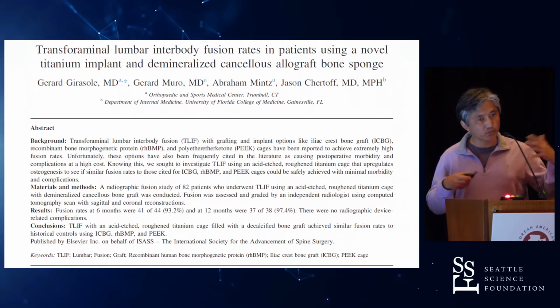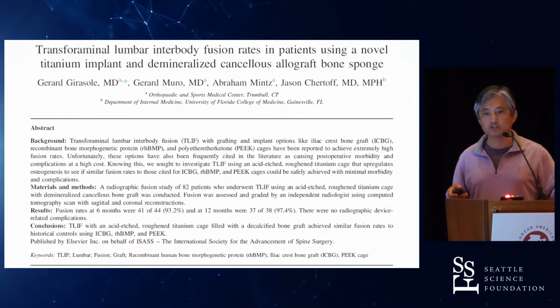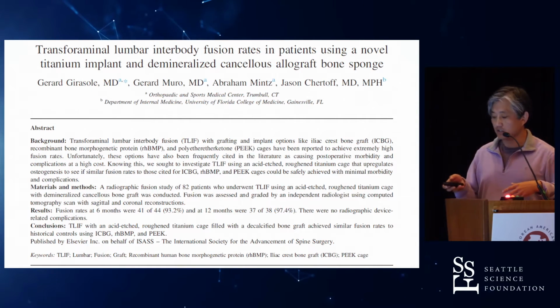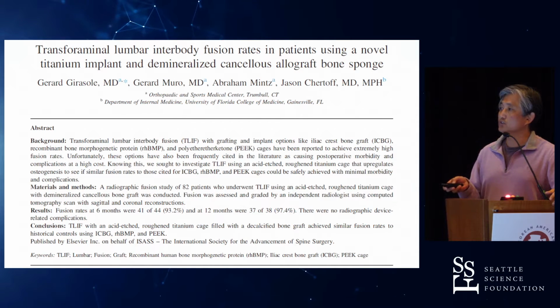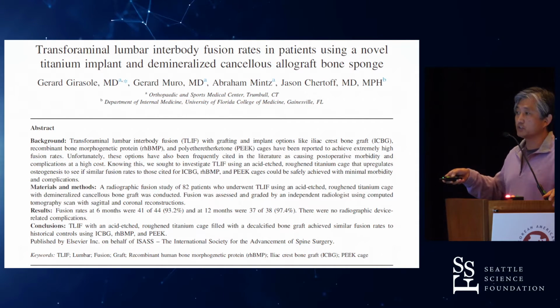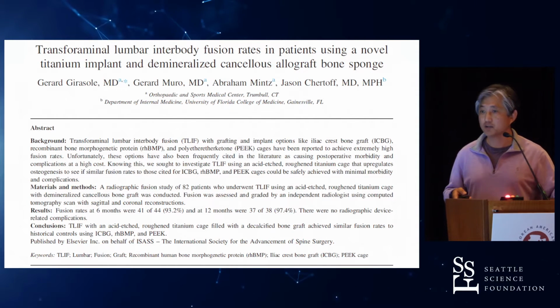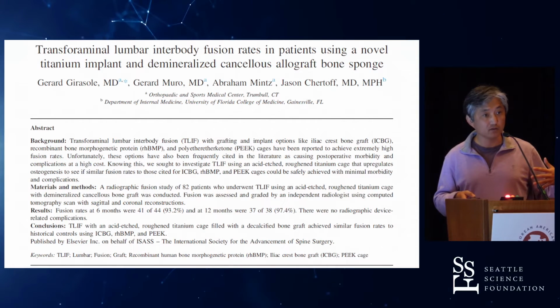Is there data that it's a far superior product? There's not a lot of literature. It's relatively new technology, as you know. And what literature there is seems to indicate that it is as good as what we've been using. I just got this one paper, just to cite to you, that when you look at the technology of doing TLIF using PEEK cages versus the titanium etched implants, the fusion rates are very good. They're in the 90 percentile, which I don't understand because I can never achieve 90 percentile in my clinical practice. But nevertheless, they're very good and it's equivalent to what we're doing now.